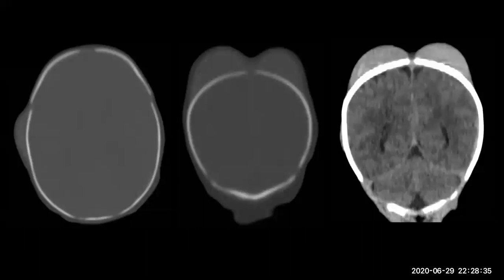Okay, and this patient has bilateral findings. You can describe the finding here. Multiple CT scan images at the axial and coronal level show evidence of localized soft tissue density swelling on the right parietal region, and on coronal imaging the bilateral swelling limited by the sagittal suture. On soft tissue window, it appears dense. So it's parietal, on the right side here, localized at the parietal region.